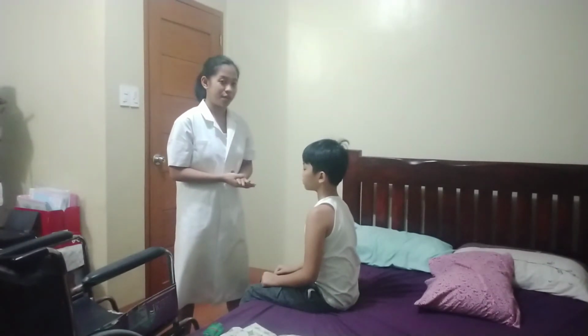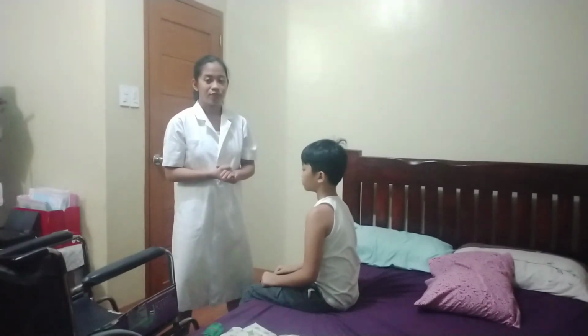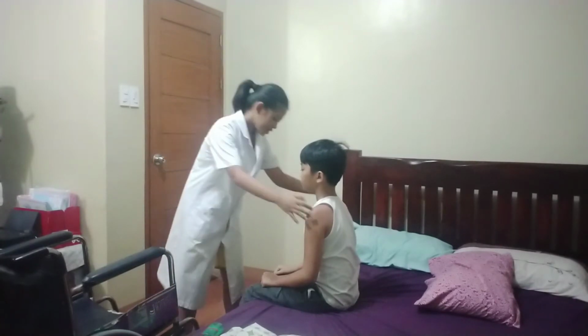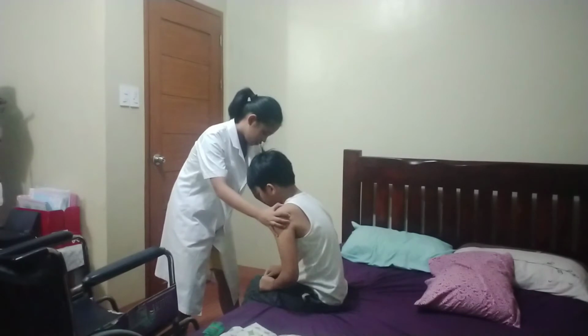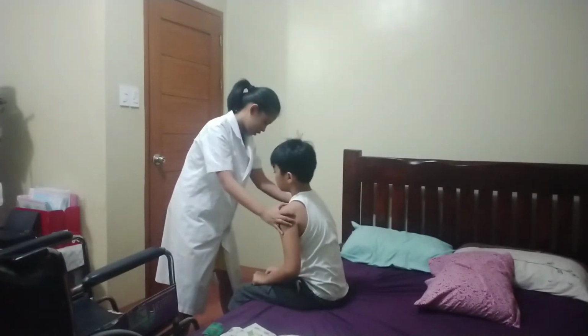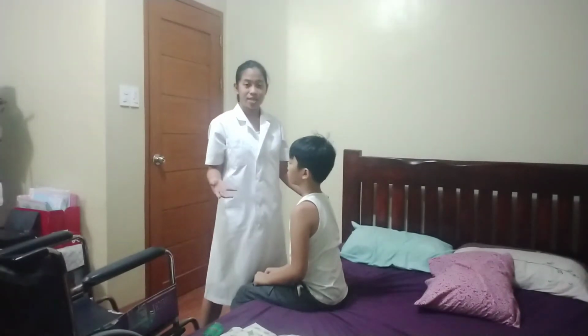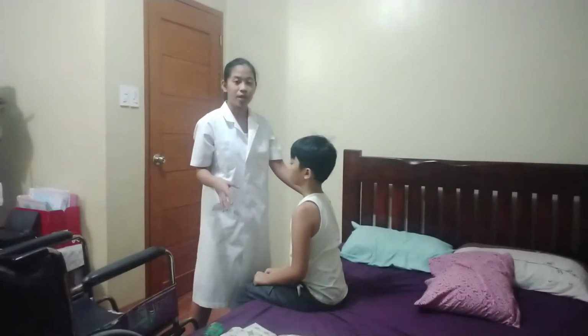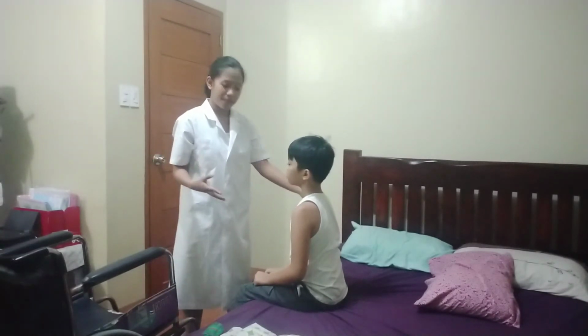And then I will ask my patient to slide his buttocks over the edge of the bed until the foot touches the floor. Okay, sir, kaya mo po bang mag-move forward para po mag-touch yung floor? Okay, very good po. And then I will position myself as close as possible to the patient with my foot position on the outside of my patient's foot.